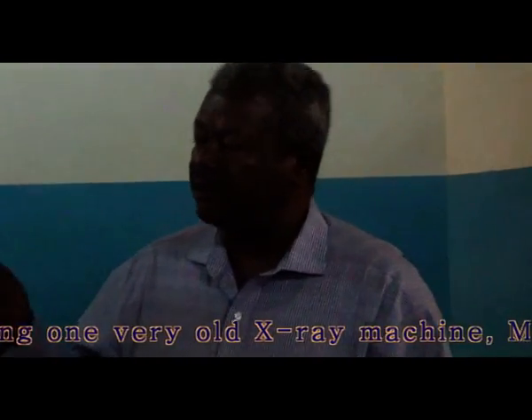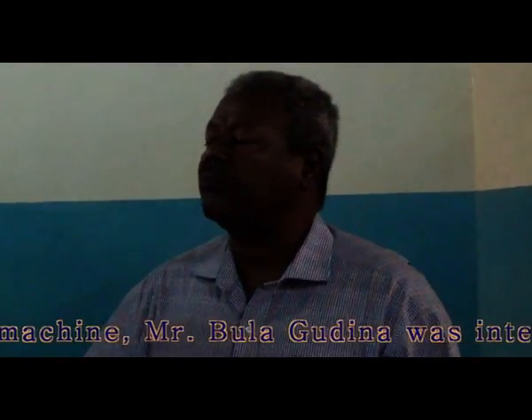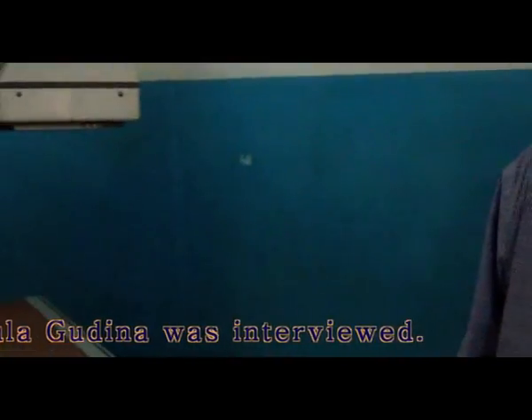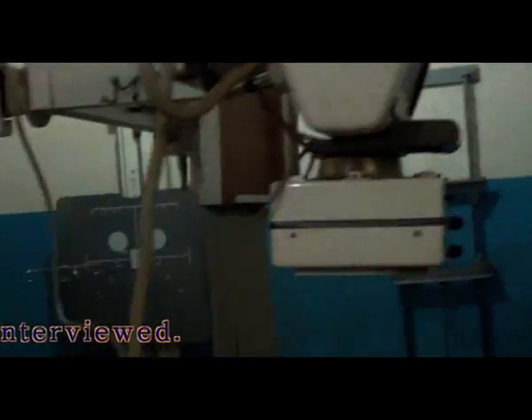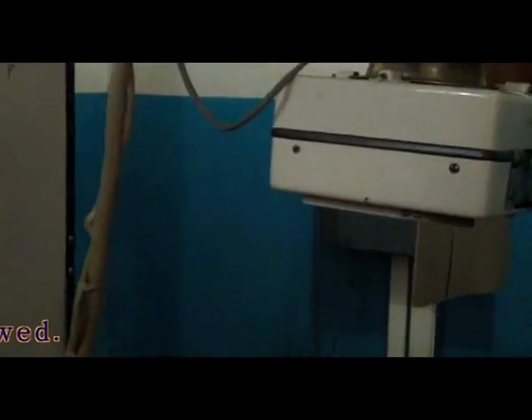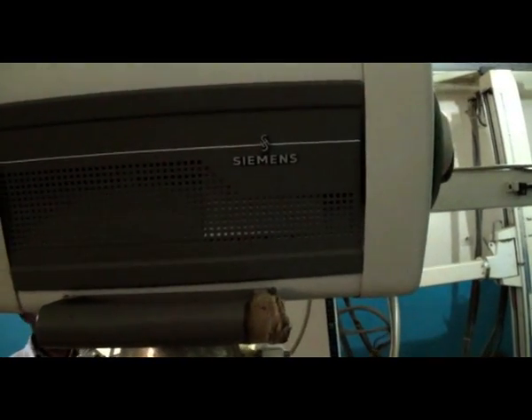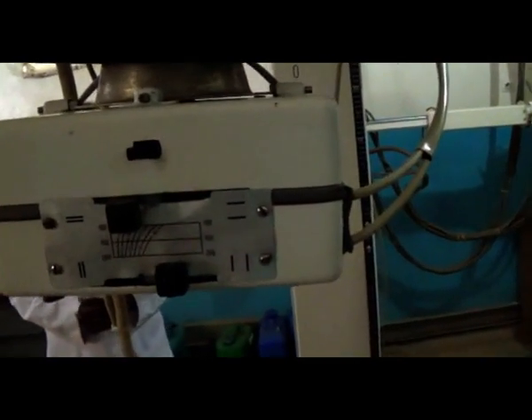Using this old machine, which has high deviation or very low deviation, what do you think the outcome of the patient, the curability of the patient, is? Yeah, that is the problem. We cannot sometimes get a good diagnosis. The doctor cannot diagnose very well. Sometimes the image will be darker than we need, and sometimes very light, which is very bad for diagnosis. That is why we really need a new X-ray machine.